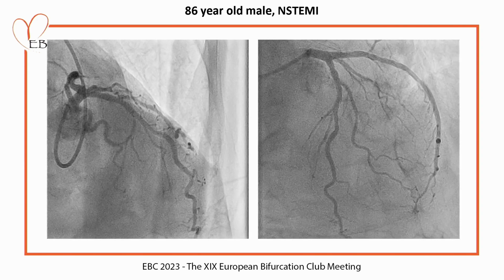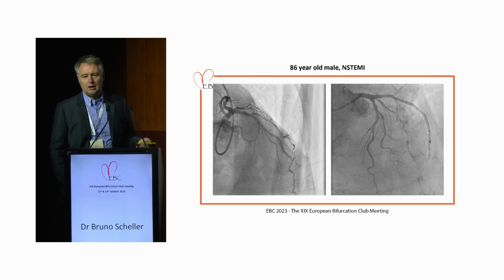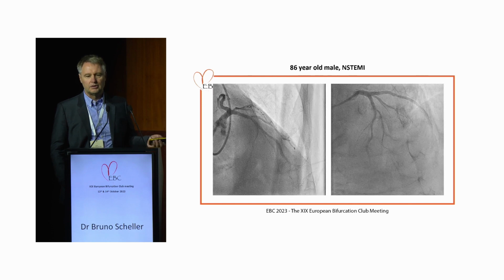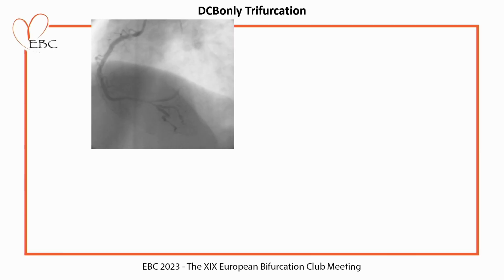This is a very simple procedure. It's done in 15 minutes. And you can see this is an acceptable result with good flow, and there's no need for stenting in this situation. Another case, a trifurcation in the right coronary artery.